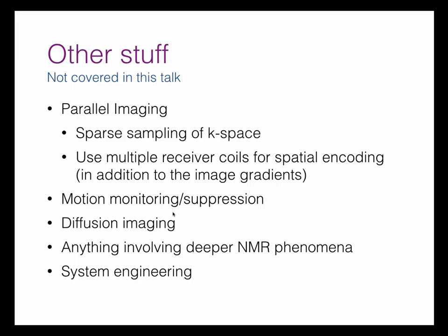Essentially, there's not really any preferred directions in MR, so you can usually choose your directions. There's no systematic preferred direction, so you can usually choose your orientations of slices and so on to help with things like limitations on the field of view. If you want a large field of view, you might end up having to encode for longer, just to collect stuff you don't really want, right?